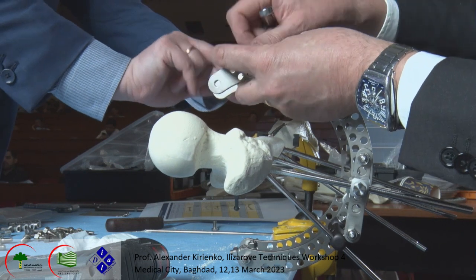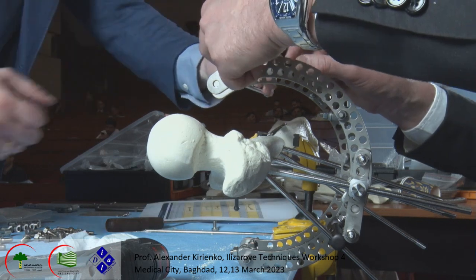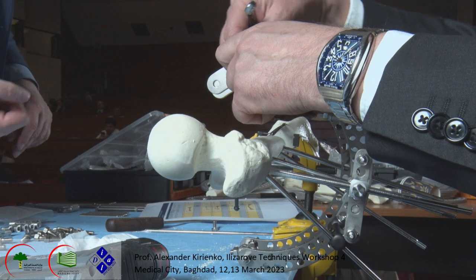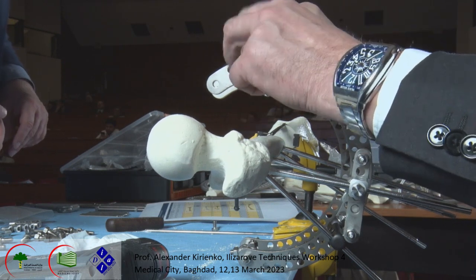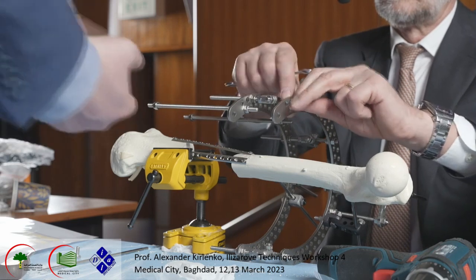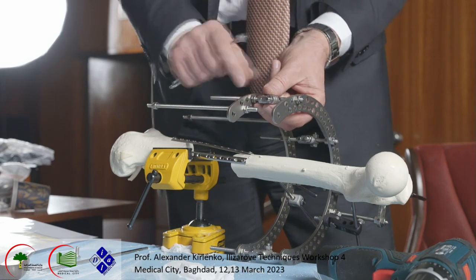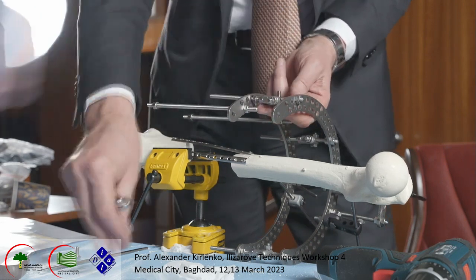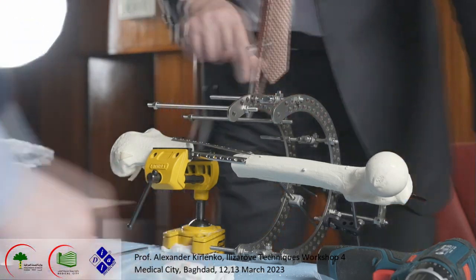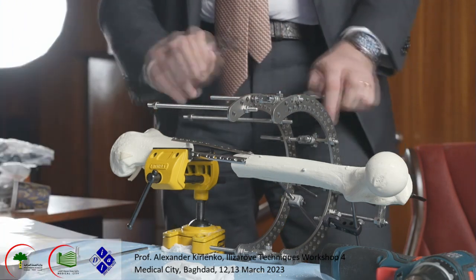Keep it, realign it. Perfect. Always like this. Adapt like a lens. Always control the position, because the hinges should all be in the same plane.